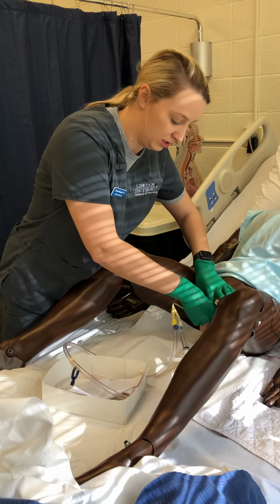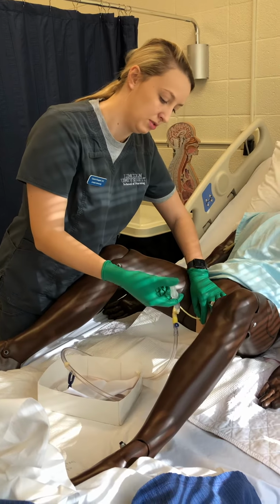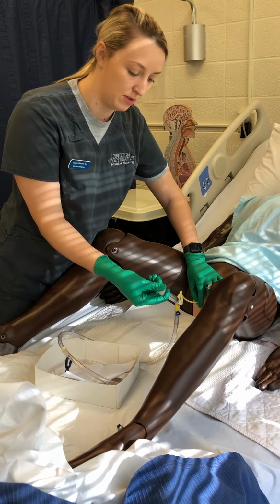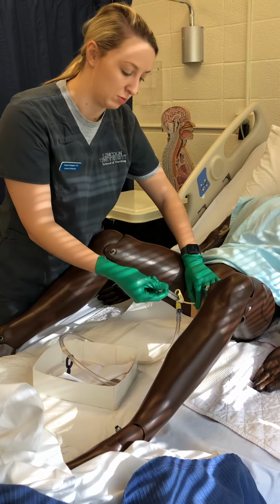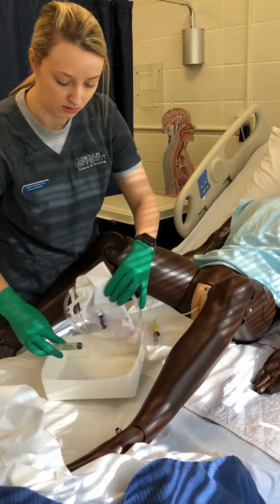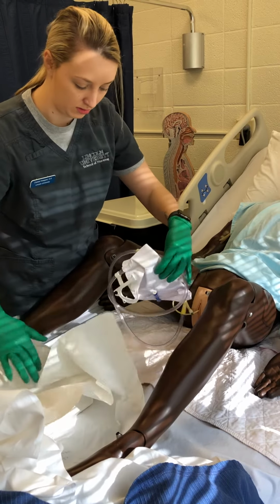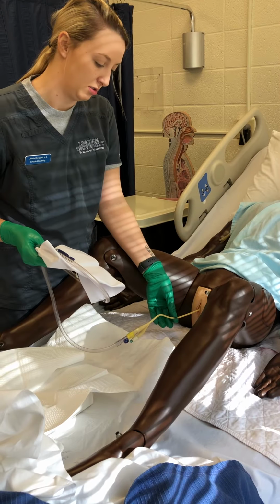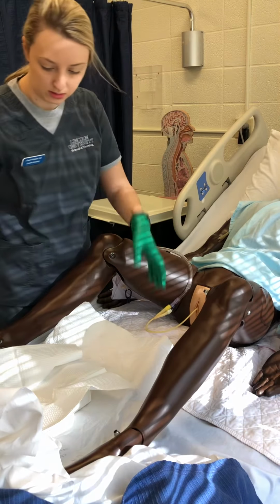Once it's in that far, I would hold it and inflate my balloon. If the patient had any pain while I was inflating the balloon, I would stop and then either push it in further because it's probably stuck in the urethra. And then I'm going to do a gentle tug just to make sure it's in there, which it is. Place this.